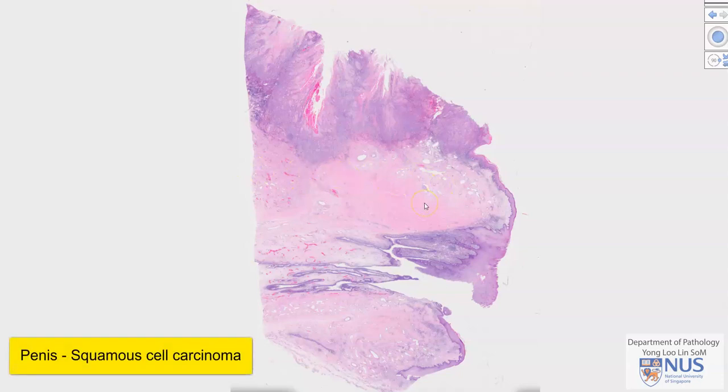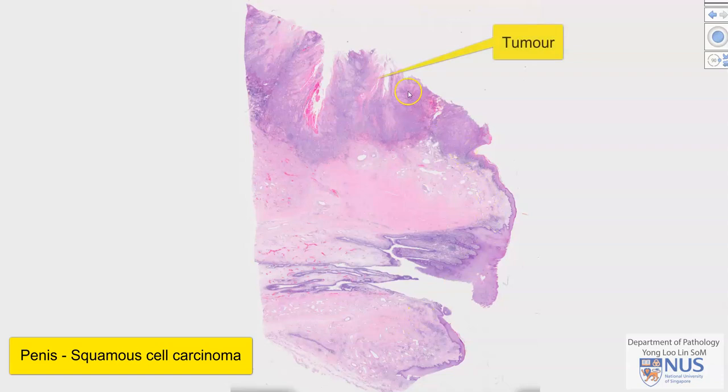Hello, this is a virtual microscopy slide of squamous cell carcinoma of the penis. We are looking at the glans penis here, and this is the tumor.